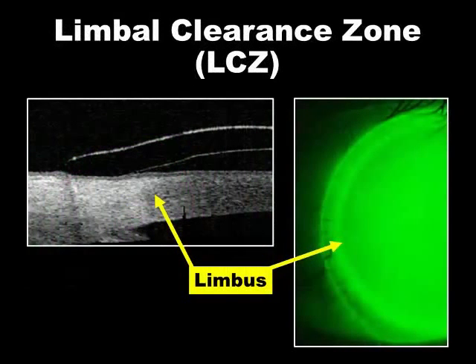Now, similar to the ICD 16.5, with the 14.5 you want to vault through the limbus. You have less real estate to do so because it's a smaller diameter lens. There'll be less of the vault through well into the conj, but the goal is to make sure that you have this vault through the limbus, like you can see here.